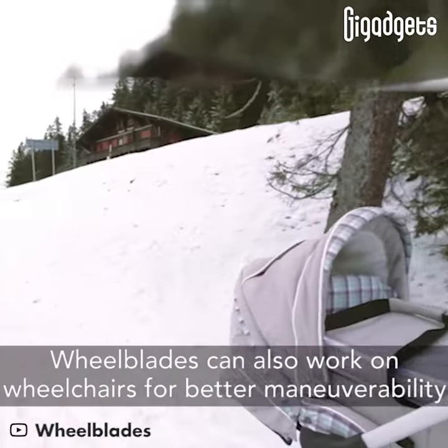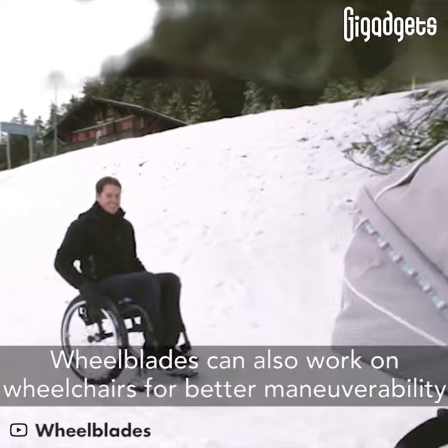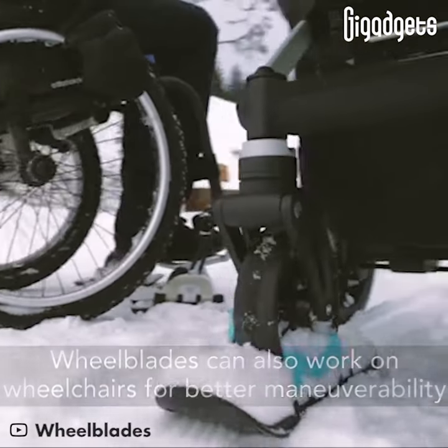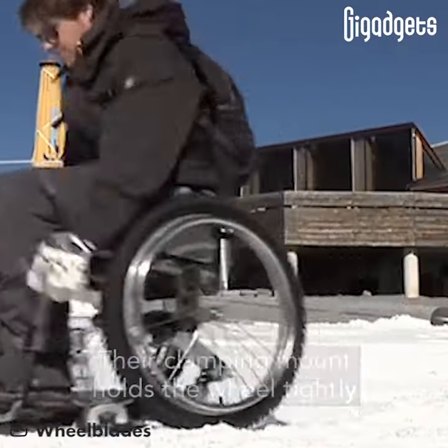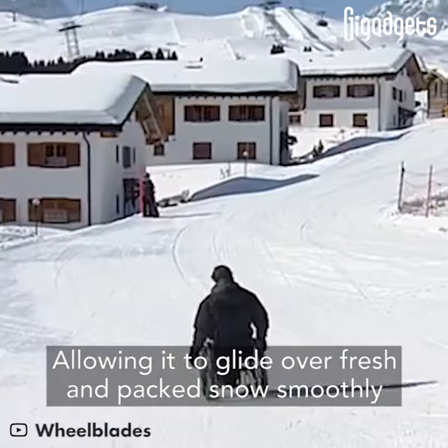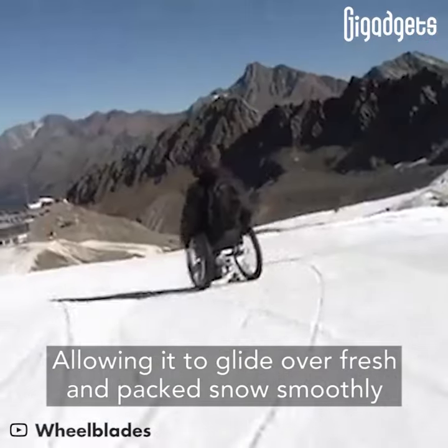Wheel blades can also work on wheelchairs for better maneuverability. Their clamping mount holds the wheel tightly, allowing it to glide over fresh and packed snow smoothly.